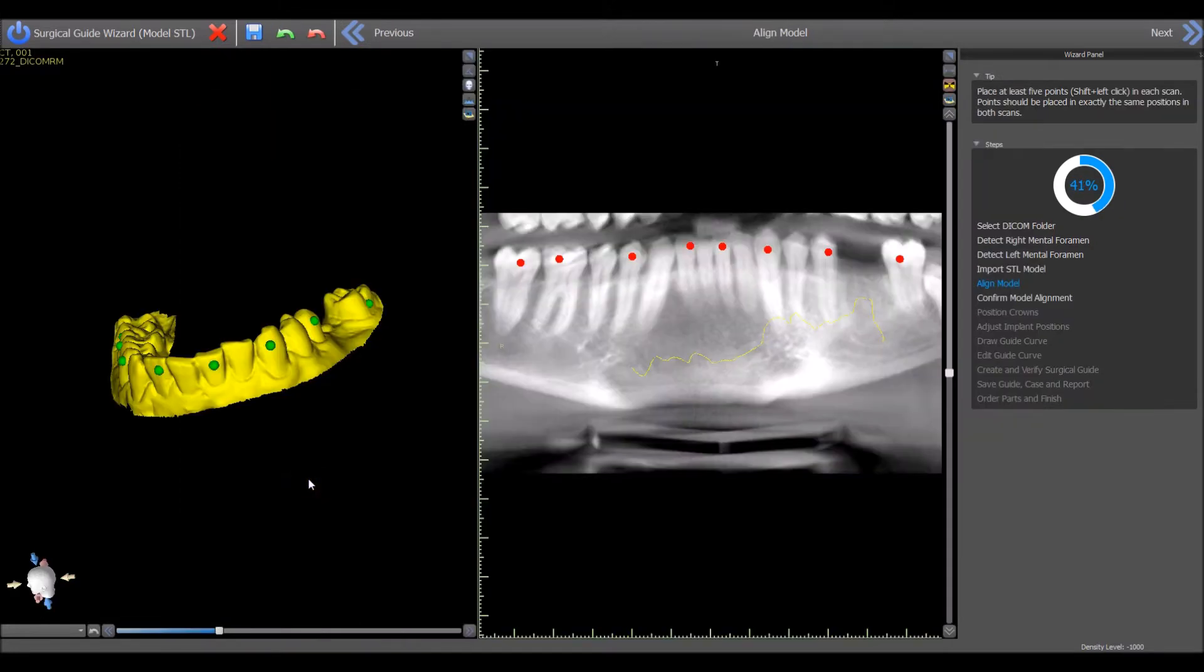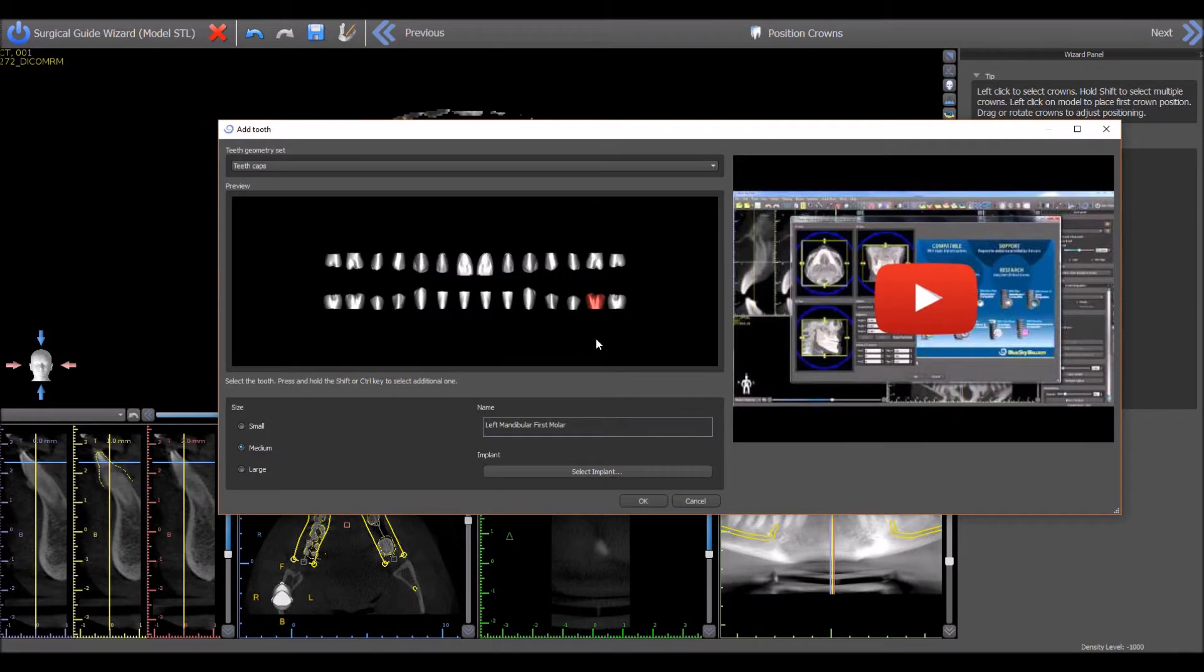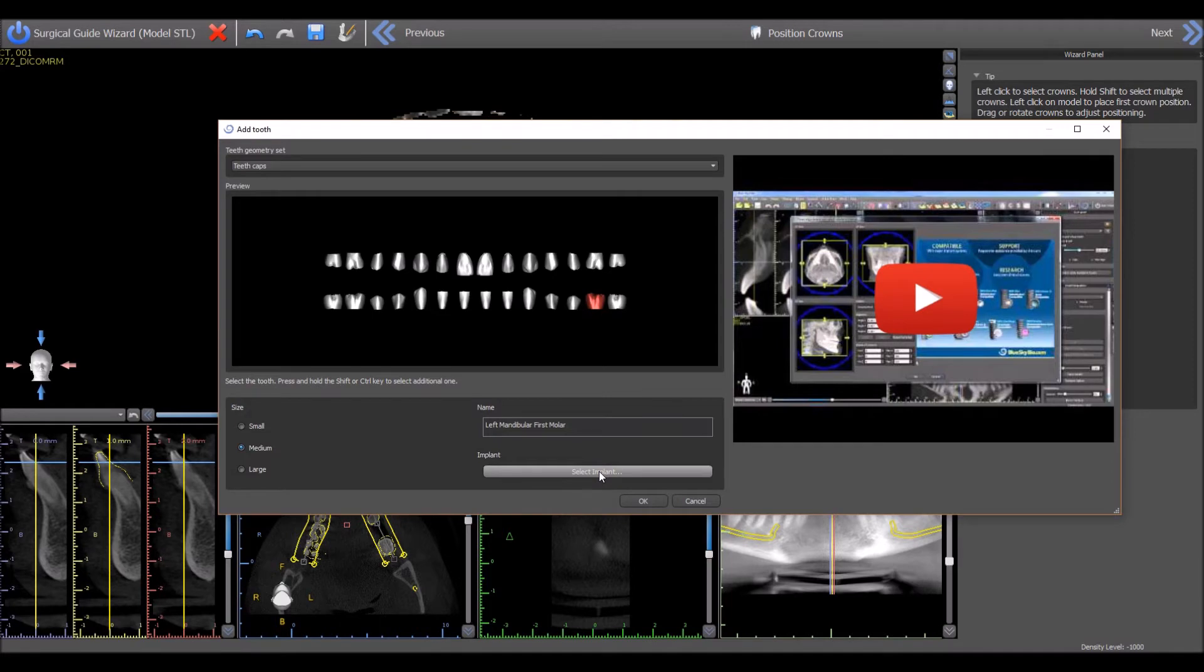select the STL model to be imported, mark the teeth to perform the merge, select the relevant virtual tooth and then press the select implant button.